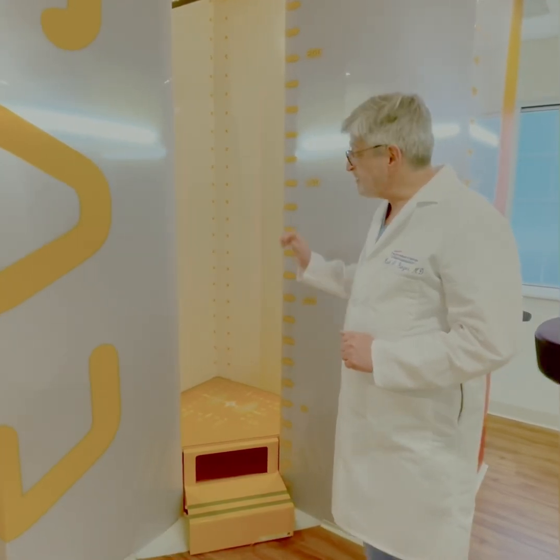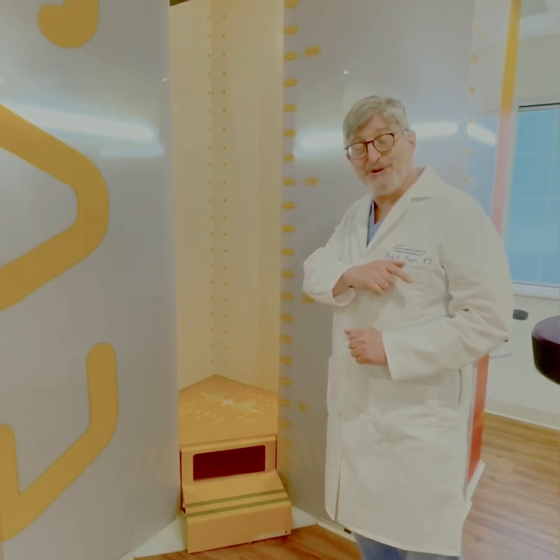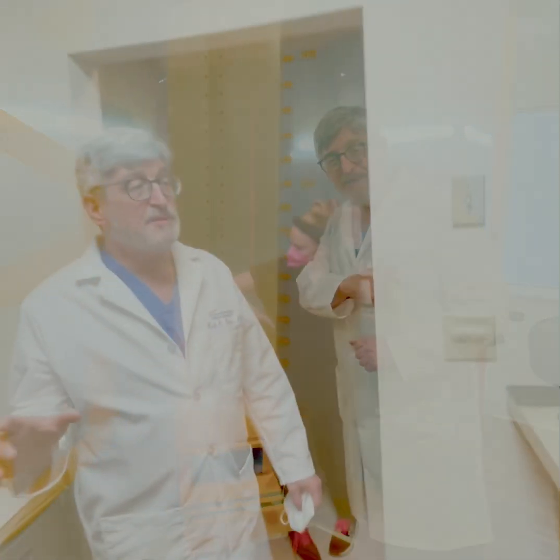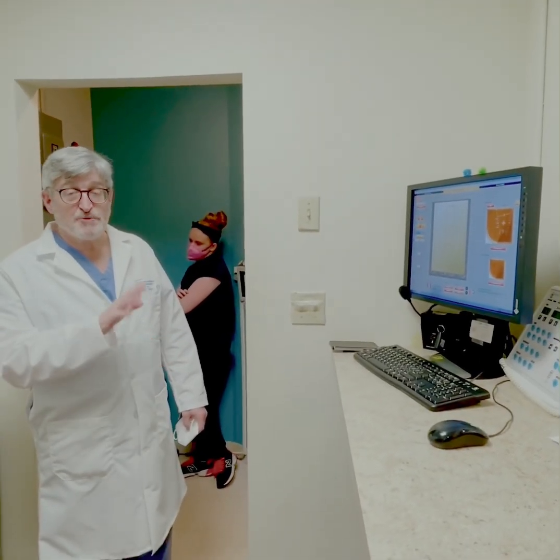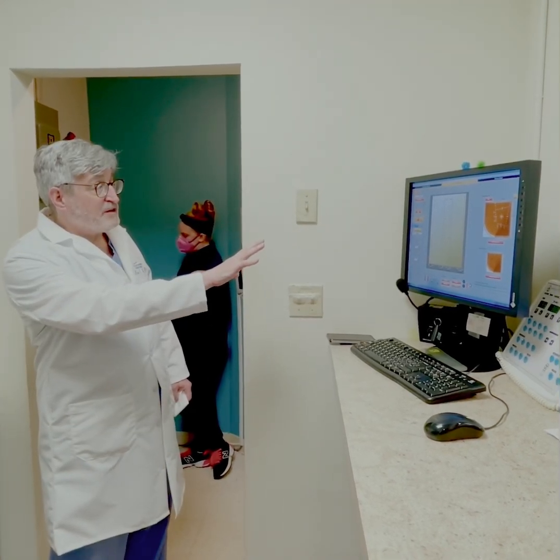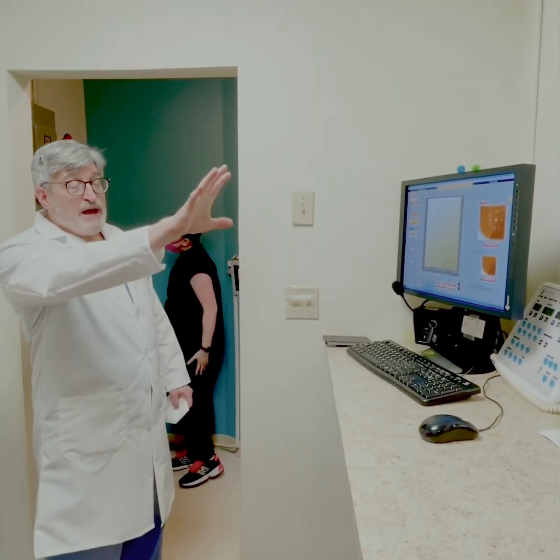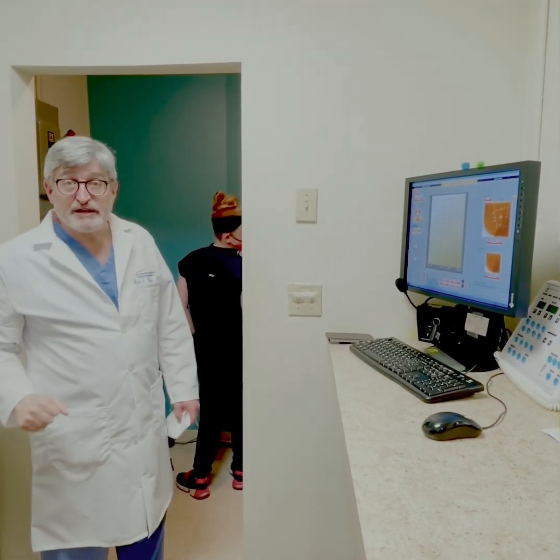So now after you've seen this, let's take you to the back where the technicians do all the hard work and make this magic happen. This is the back room where you'll see the techs in a moment. Our x-ray techs who are specially trained with this device will be using the monitor over here to program when we get the scan. And you'll see the images come up within just a few seconds.